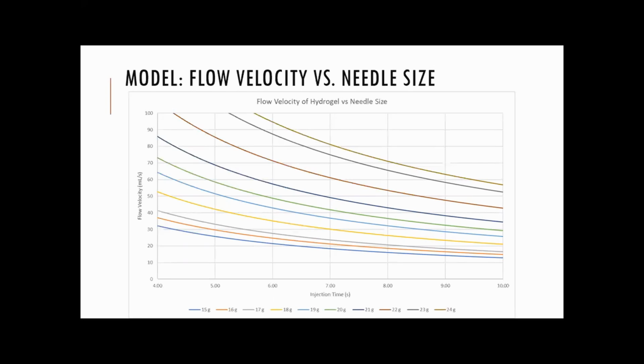In an article from the NIH, we found the average male urethra has a diameter of 8 to 9 millimeters. The tip of the 18 gauge needle has a 0.838 millimeter diameter, which means that it will cause slightly less distress to the patient than 15 to 17 gauge needles, all of which have a diameter greater than 1 millimeter. This may help patients avoid catheterization.